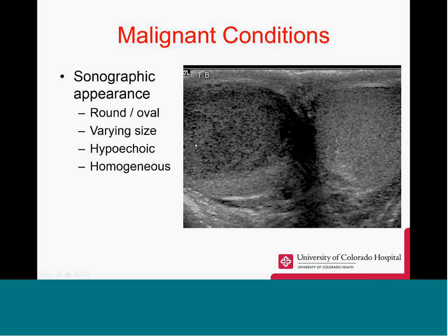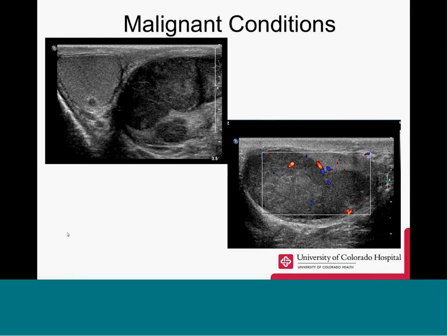Here on ultrasound, this is a rather large one, mainly filling the entire right testicle, maybe a little normal tissue here, a normal appearing left testicle. More seminomas. You can see why this gentleman would come with a unilateral testicular enlargement, a large mass within the left testicle, hypoechoic with Doppler flow.